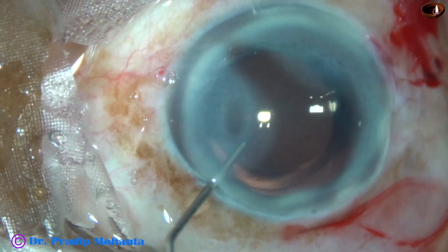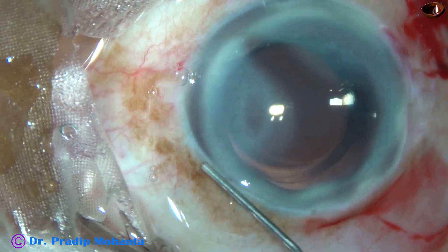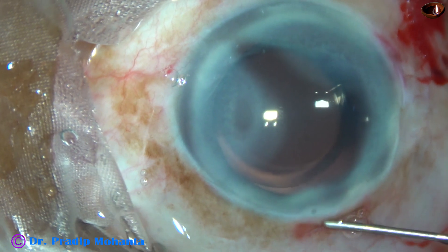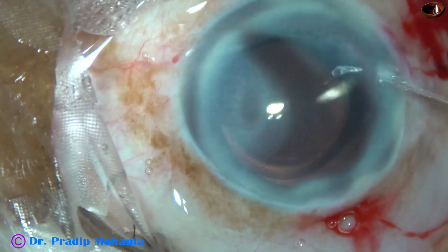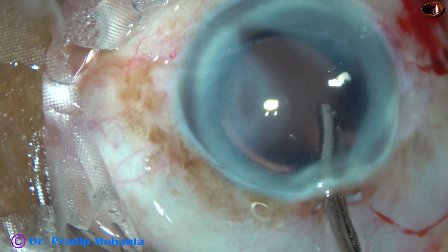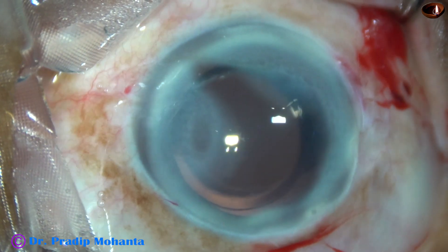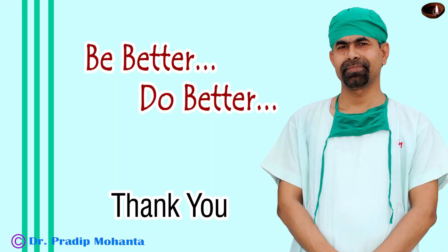And now this is moxifloxacin. Now the left side port is being closed very nicely. The right side port need not be closed because only small instruments have gone through that and it doesn't need any hydration. Now this is the final pressurization of the anterior chamber — a gentle stream of fluid is directed towards the cornea and visco from the corneal endothelium is cleaned. With a cotton-tipped applicator, integrity of the wounds is checked. Few drops of moxifloxacin are applied to the cornea and the case is concluded. Thank you very much for your attention.